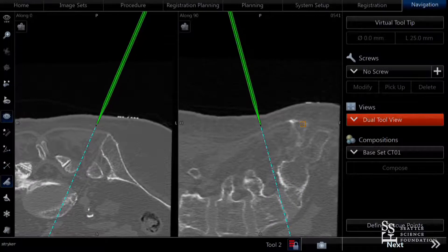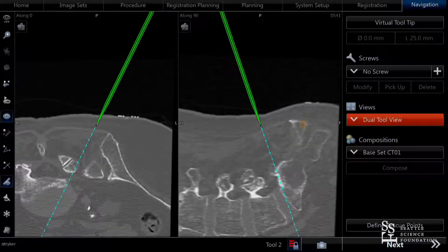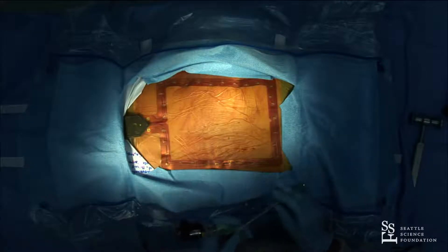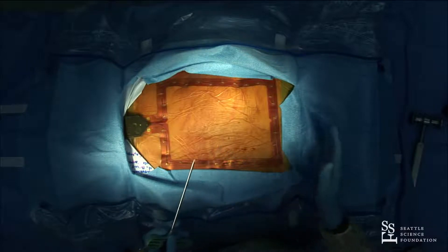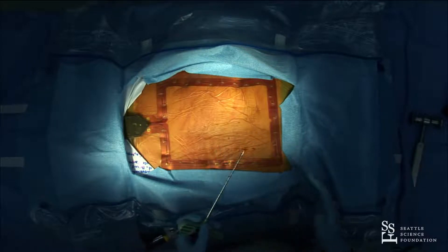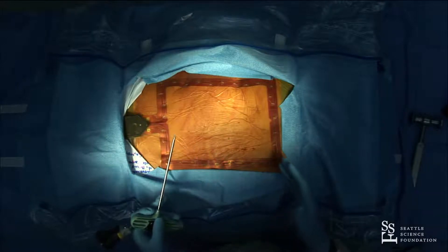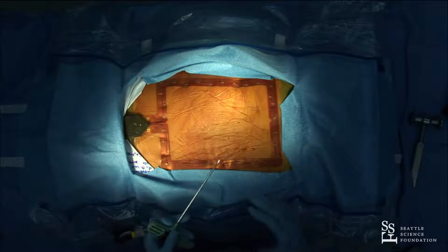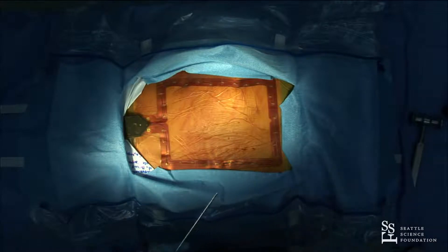There's a question about how wide an area to anticipate and where to put the mask. When I'm doing decompressions, I put the mask around the area where I'm working. The thing to be wary of with the skin-based mask is that anytime you manipulate or move the skin, the mask will shift — almost like if you had a bone-based tracker in the pelvis and moved it.